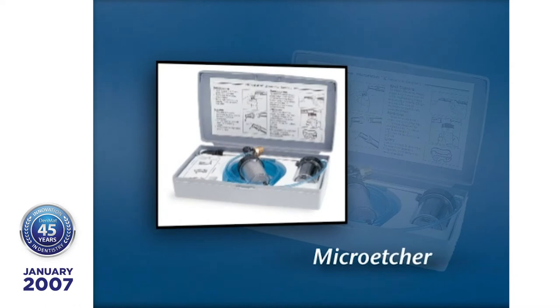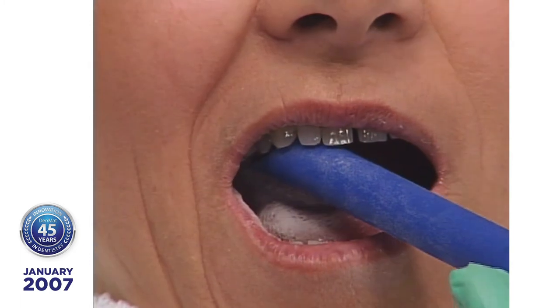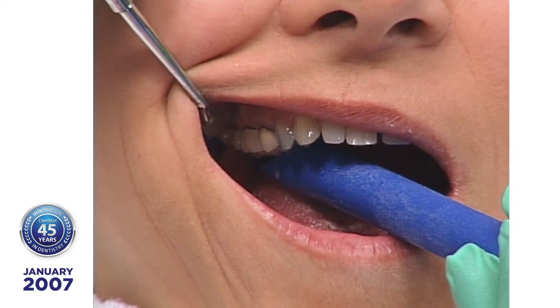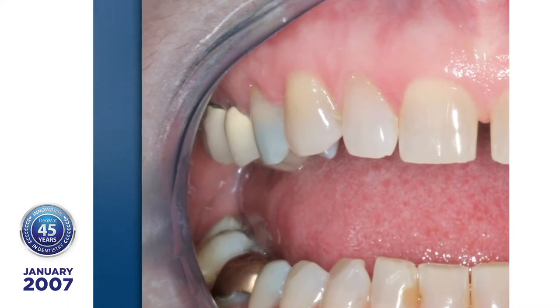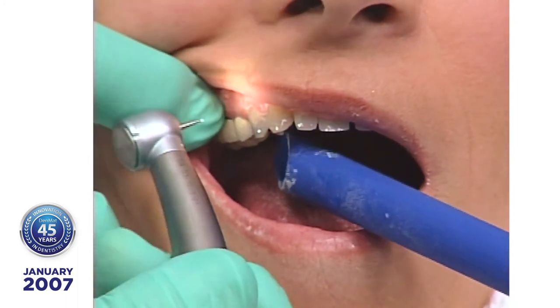We'll take the micro-etcher and do a little sandblasting here. You can use any brand of micro-etcher that you want. One challenge as I'm looking in there closely is you can see that metal margin. Probably all your patients that have porcelain-fused-to-metal crowns in there for five years, 98% of them have metal margins showing. What we're going to do is create a little trough with a small round diamond. You shouldn't feel anything — if you do, raise your left hand right away and I'll stop. We never put burrs on teeth; we put diamonds on teeth.